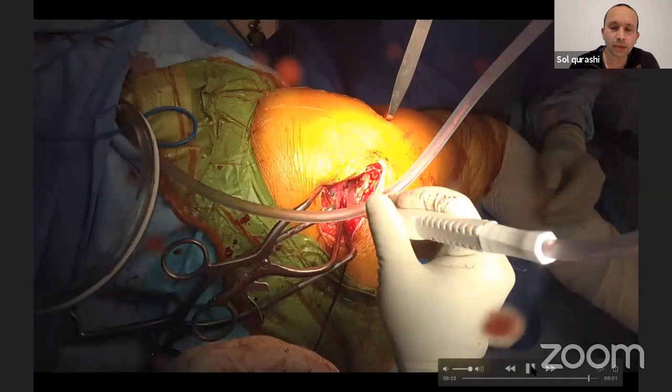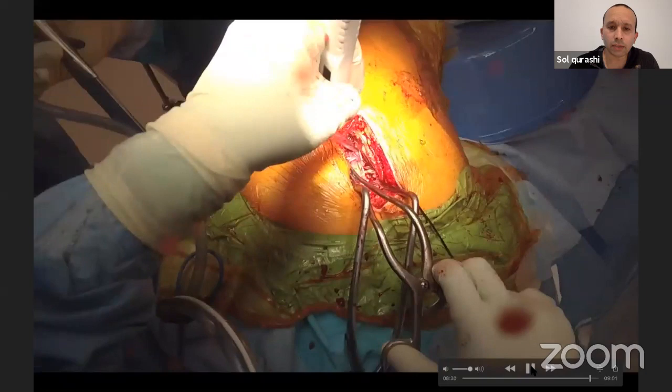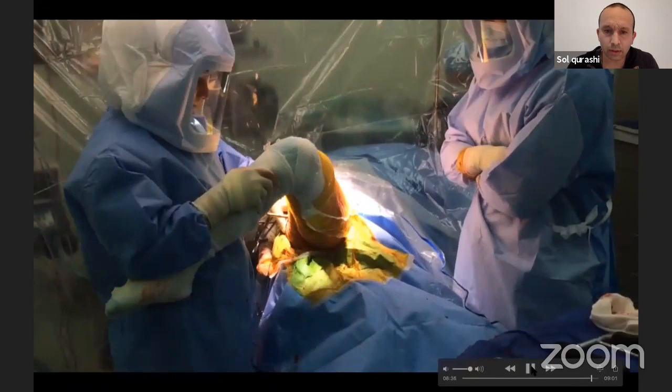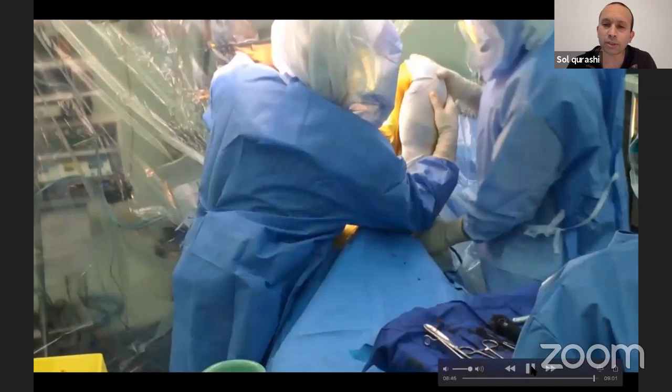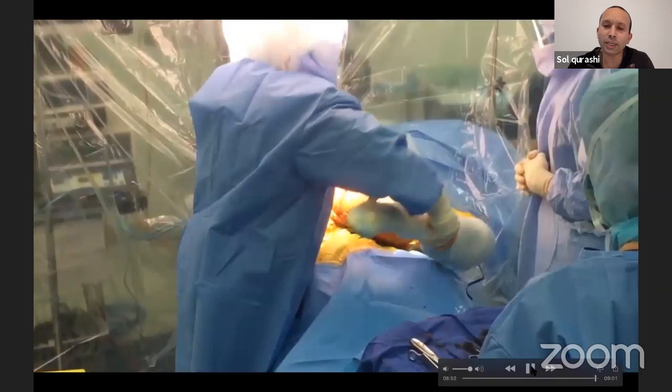And there's my piriformis. This is my routine trial for every patient. Obviously not at the time of the implant, this is at the time of the trial reduction. We make sure that this construct is not dislocatable on the table. And if it is, then we need to modify implant position or whatever we need to do to get that. So the external rotators are stopping us from internally rotating any further. So you basically come across a lot of resistance.